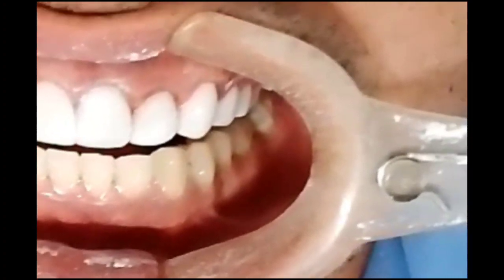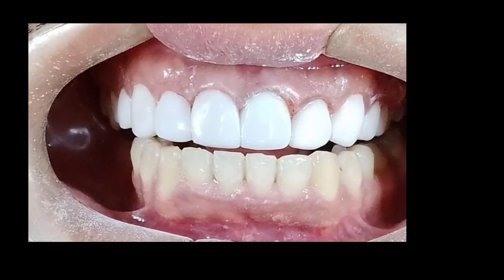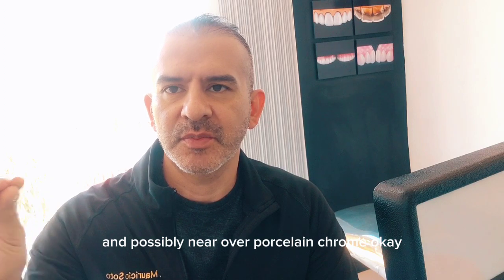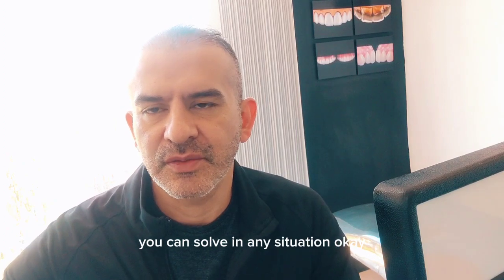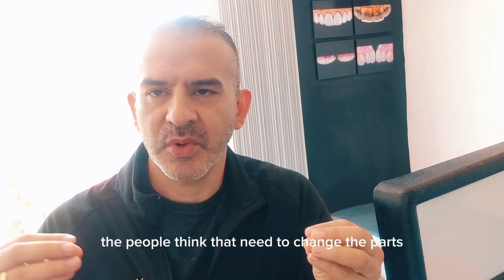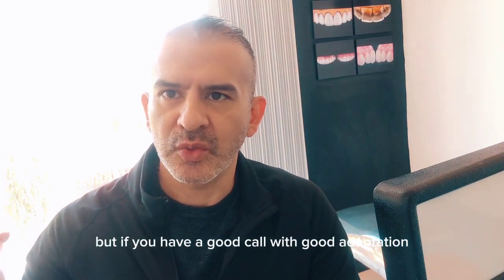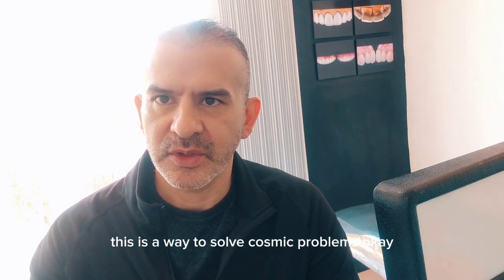Now after finishing all the veneers, the patient has a new smile and keeps his porcelain. We finish. Now you know that you can do a composite veneer over a porcelain crown. This is important because in this way you can solve many situations. Most of the time people think that they need to change the porcelain crown for a composite veneer. But if you have a good crown with good adaptation, this is a way to solve cosmetic problems.